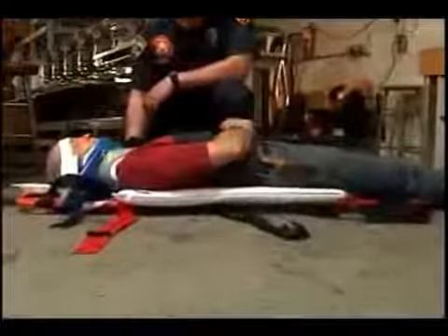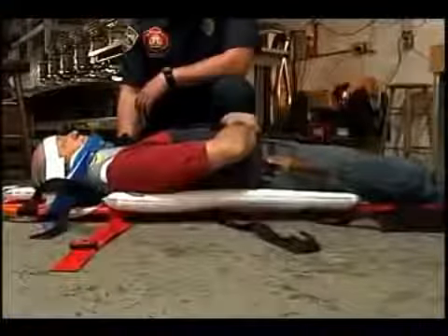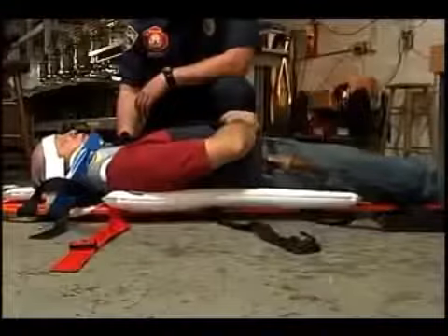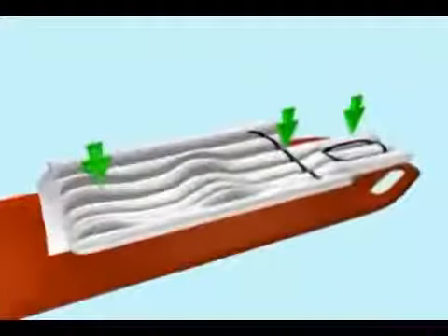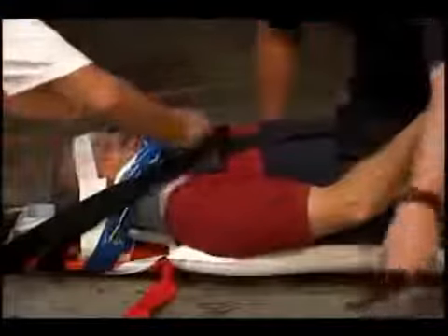The proper level of inflation is subjective and dependent upon several points. First, confirm that voids between the patient and backboard have been filled. If the patient is conscious, ask the patient if they are comfortable. This will confirm the pressure points have been relieved. A rule of thumb often used is to look for slight elevation of the patient's shoulders while positioned at the head and inflating. After the back raft has been appropriately inflated, begin securing strapping mechanism per your local protocol.